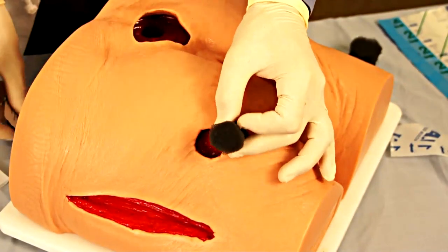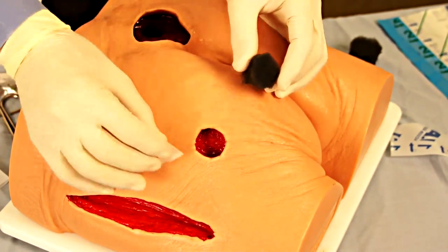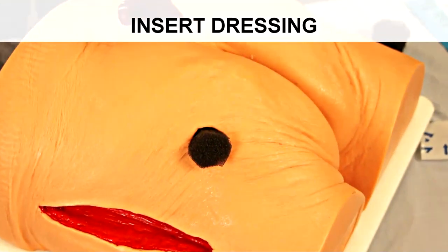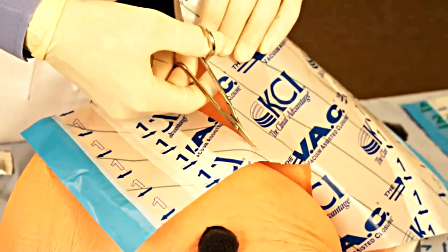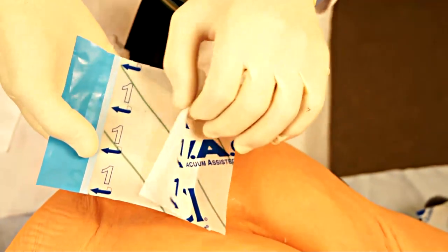Once we have sized the foam dressing appropriately, we are now ready to begin applying the dressing and the adhesive barrier that will achieve a vacuum seal for the negative pressure therapy. Initially, we would like to take skin prep and prep around the wound so that the adhesive will more readily adhere. Once this has occurred and we have inserted the foam dressing into the wound, we would select an appropriate size piece of the adhesive covering. Using our scissors, this can then be cut to an appropriate size. When working with the adhesive, it is generally easier to use if we cut in a direction that allows all edges of the adhesive backing removal to be readily accessible.